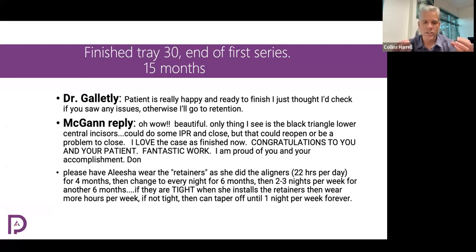And I do this to encourage the teeth to start to settle. Because as long as you're wearing the aligners 22 hours a day or the retainers 22 hours a day, there's no settling happening. And so it's difficult for me to adjust the occlusion and make sure that everything is settling into a nice intercuspation, because the aligners are in the way, they really can't settle. By titrating, giving them more and more hours during the day with them out, they're swallowing, they're functioning with the aligners out, they're starting to get their teeth to settle so that I can monitor that during the 6 months.